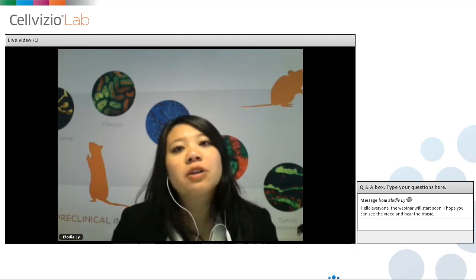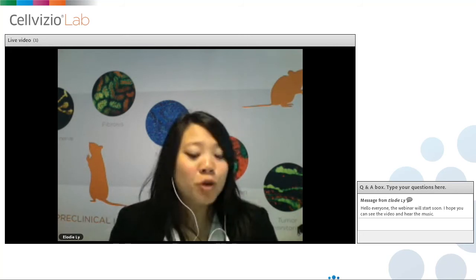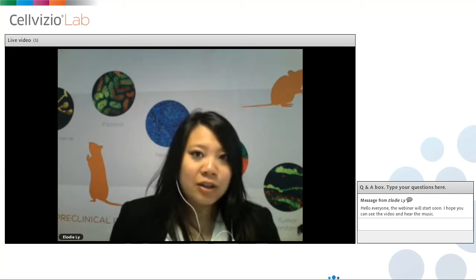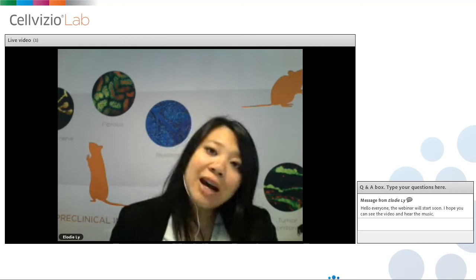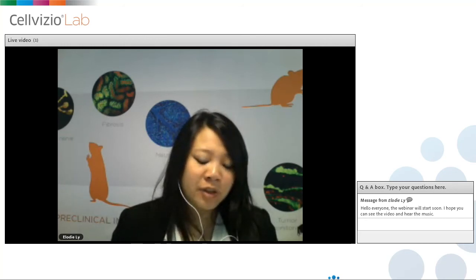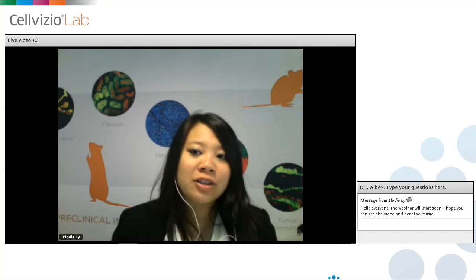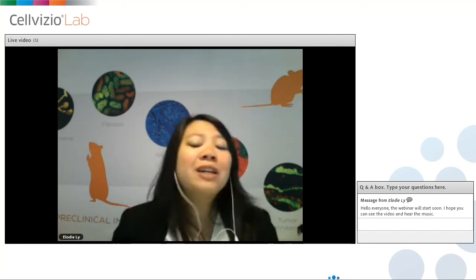However, on the videos I showed at the beginning, it is possible to see blood flowing. And just keep in mind that our standard acquisition rate is between 9 to 40 hertz. So you will need to check whether this acquisition rate is compatible with the events that you want to measure.